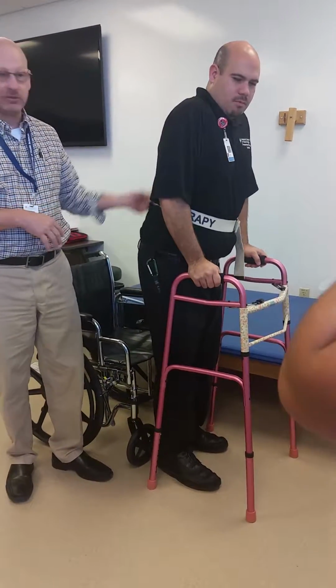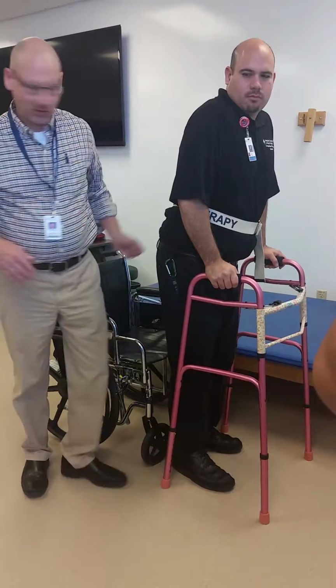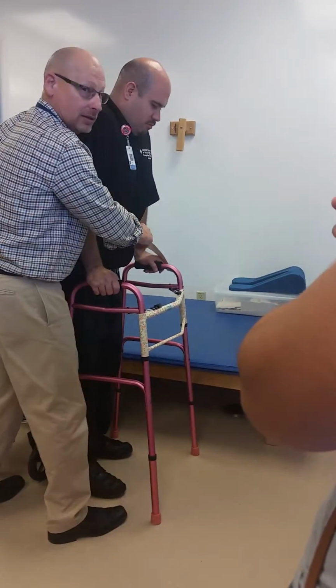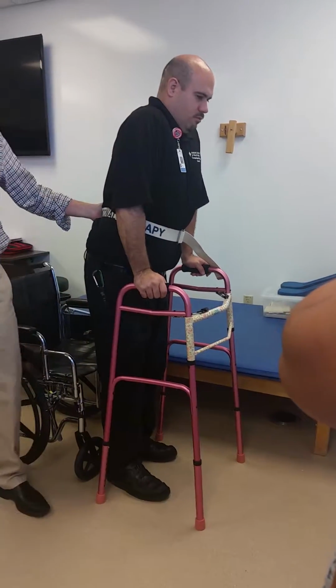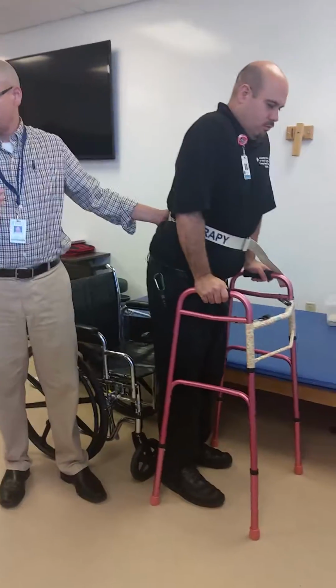Now, look how loose the belt is, by the way, once we stood up, because when we sit, our fat expands, right? So once I get up like this, if we're going to walk, I'm going to tighten this belt real quick. So it needs to be tight, right? Oh, transfers are always a work in progress. There's no such thing as a perfect transfer.